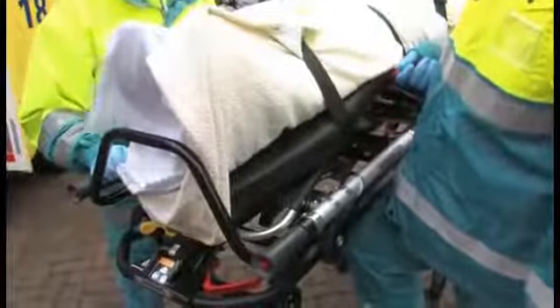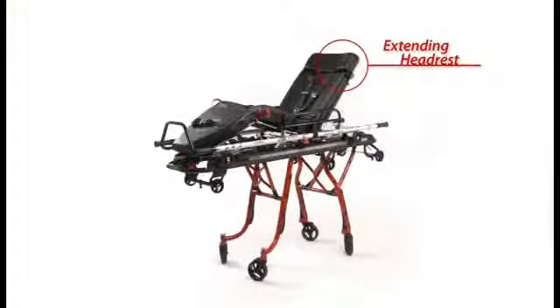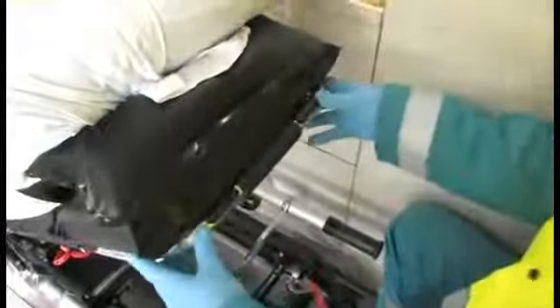Lift up on the red contour position handles in the center of the panel until the panel locks into place. To lower the contour position, lift up slightly on the end of the foot panel, press the foot end tabs, and lower the contour position. To extend the headrest for taller patients, grab the head end bar and pull out until it locks. To retract, push in until it locks.